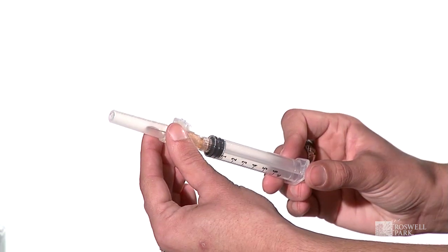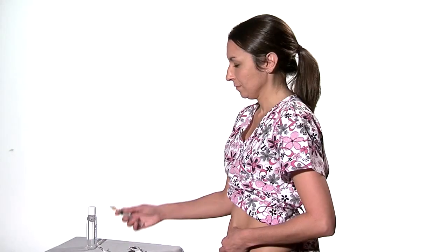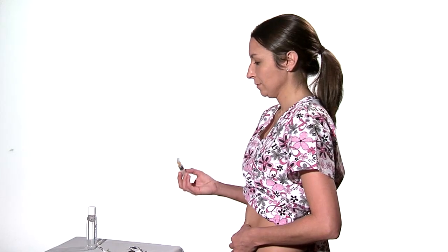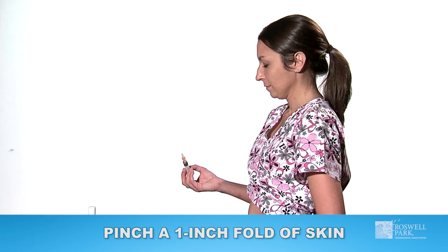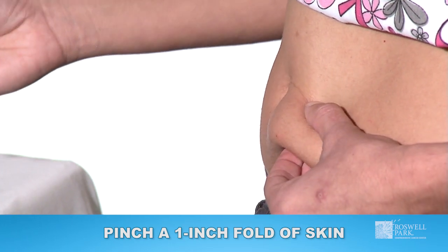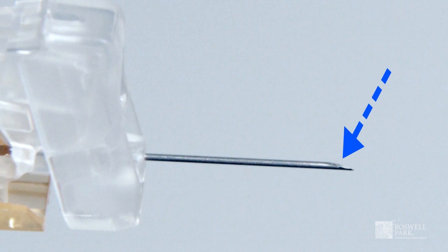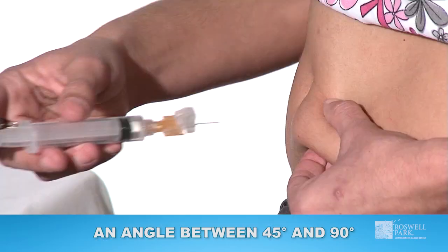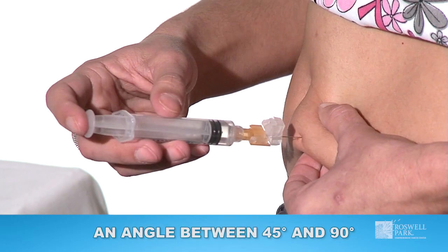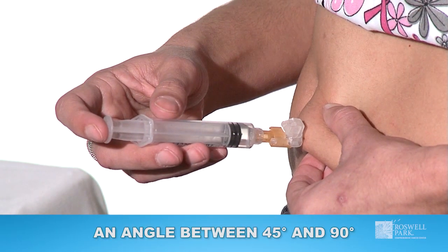After the skin is dry, remove the needle sheath from the syringe. Then hold the injecting syringe in your dominant hand and use the other hand to pinch a one-inch fold of skin. Make sure the angled or beveled side of the needle is facing up. Then, with a quick, smooth motion, push the needle into the skin at an angle between 45 and 90 degrees.